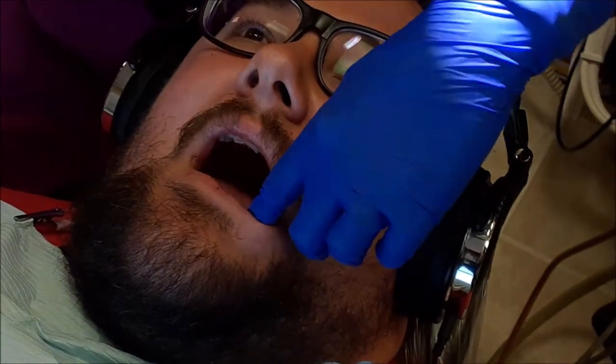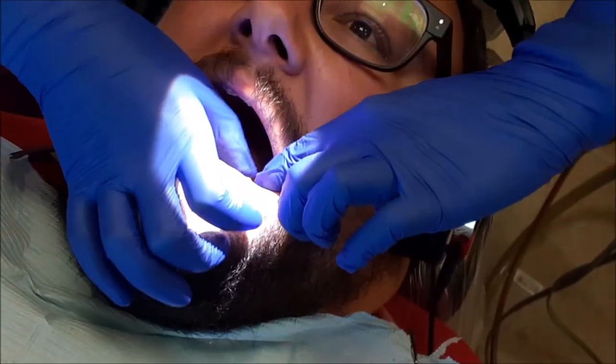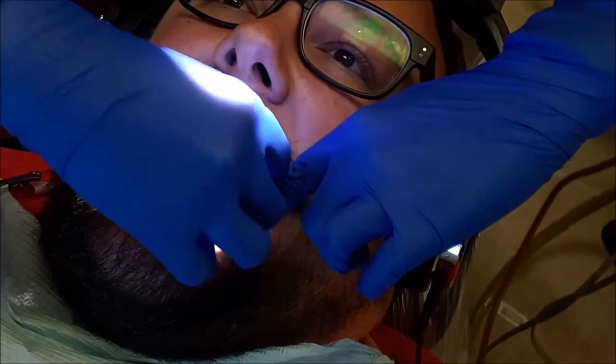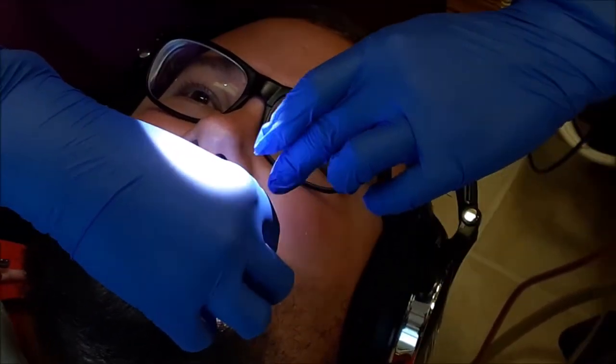And then stay open for me, it stays dry. And then bite down on that for me. Good, and put good solid pressure while that sets. Oh, it's so pretty. Better than it's looked in over a year, huh?